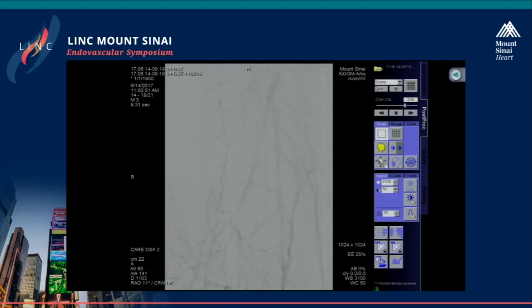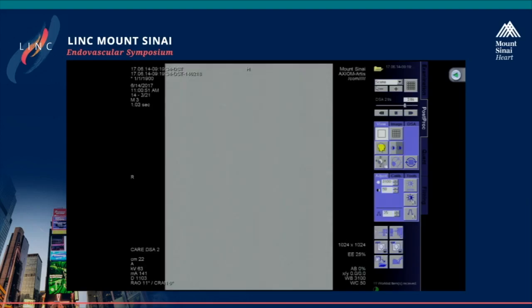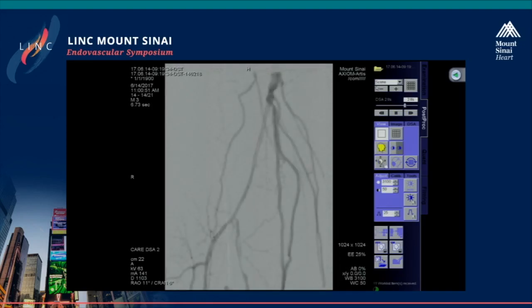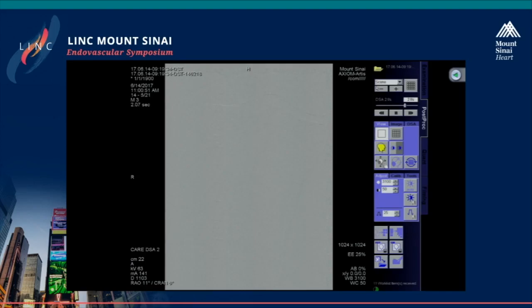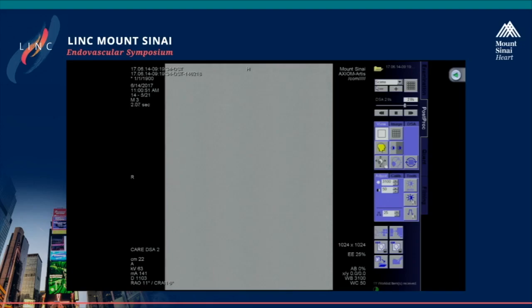Can we see this last angiogram? That looks beautiful. Can we see again the last angiogram? Yes, Dr. Bienvenido. So you can see here, Dr. Bienvenido, what we did was, because we felt we were not subintimal, we did two passes with the SilverHawk. Okay, but you already have a perfect result. When you already have a perfect atherectomy result, you can go ahead with a balloon. Why take the risk of a perforation, particularly at the reconnection point at the bifurcation?